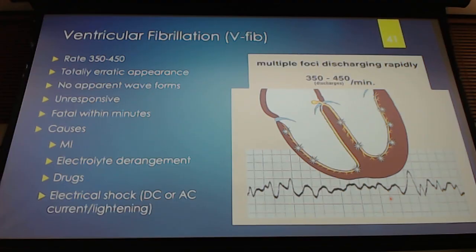Okay? And then the other thing that can cause this, where you guys may see it, because oftentimes you guys will not be seeing this older population, especially active duty folks, is electrical shock. Someone that came in and they got shocked. Even though we might think it's a minor shock, certainly if they're coming in unresponsive, it's not minor, but in general, when patients come in and they've gotten shocked, you always want to make sure that you get an ECG on them to look for any arrhythmia, even if it seems like a minor shock. Okay? Pregnant patients, especially, must have an ECG.